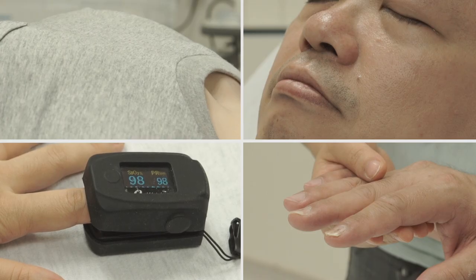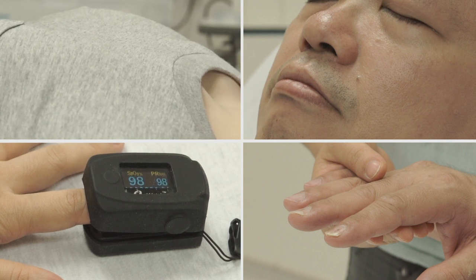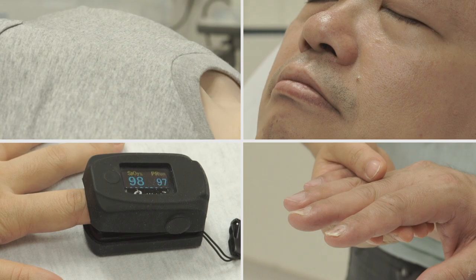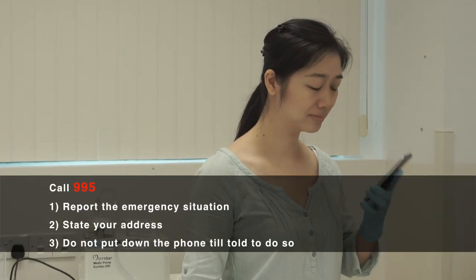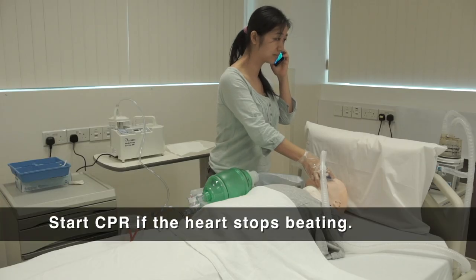Monitor the patient for the colour of the face and fingernails, SpO2 levels, and heart rate. Contact the ambulance if the patient becomes unstable or unconscious. Start performing CPR if the heart stops beating.